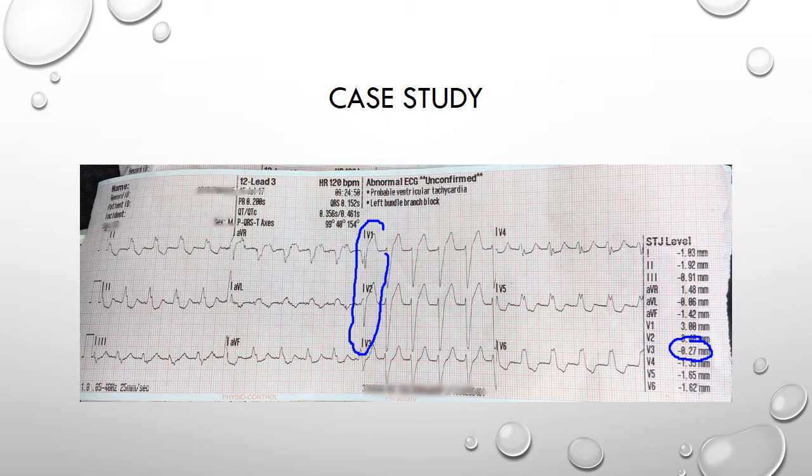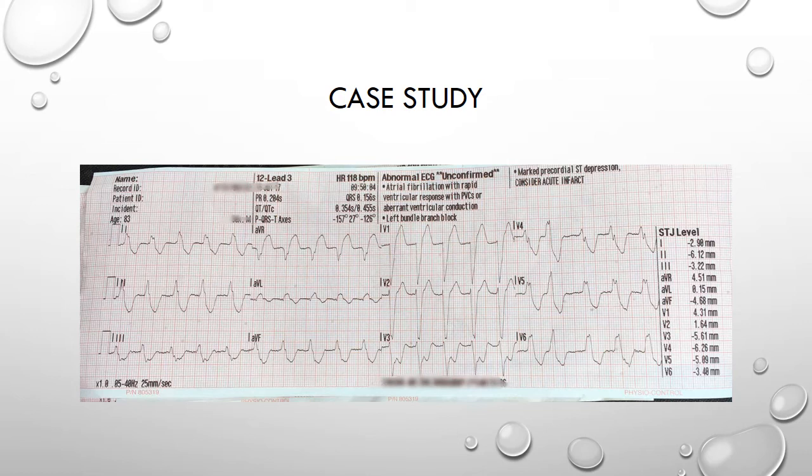The crew demonstrated good clinical practice and performed repeat ECGs whilst the patient was in their care. This ECG, recorded about 25 minutes after the last one and coinciding with the patient becoming pale and clammy, clearly shows dynamic changes — most notably to lead V3. There is now huge concordant ST depression of over five and a half millimetres in that lead, and that now meets Sgarbosa criteria for an acute occlusion. Lead V1 is also coming close to scoring two points with ST elevation of 4.31 millimetres.